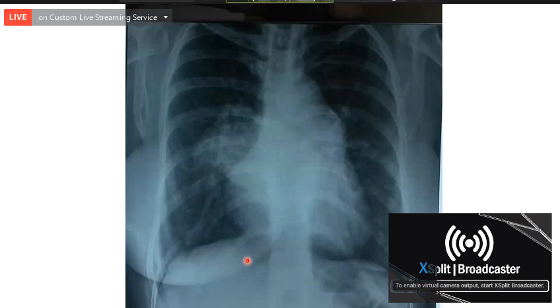What is this? Anyone of you? Chest X-ray PA view with well centralized film. Okay. Situs solitus. Yes. With LV type of apex.